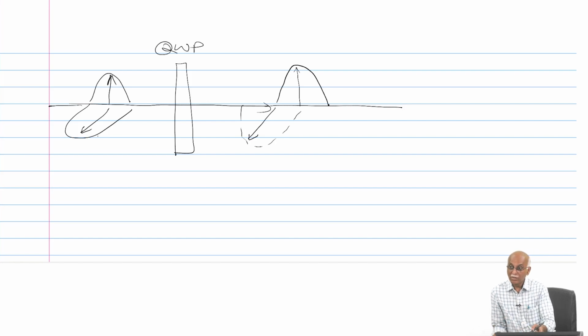Now, if you see this, it is a circularly polarized light beam. It will move like this, helical, right. The polarization state will keep on going, maximum here where 0 is. So, vertical, then it goes like this. Can you imagine? So, this quarter wave plate helps us convert a vertically polarized light beam into horizontal and vertical components, and then into a circularly polarized light beam.